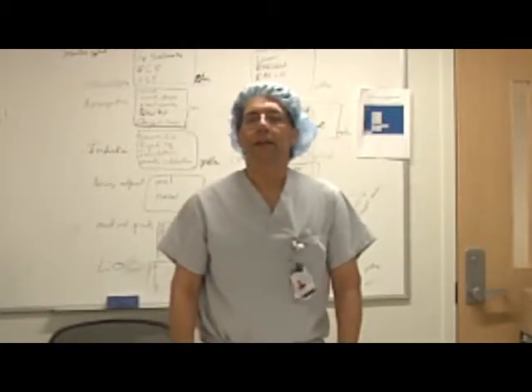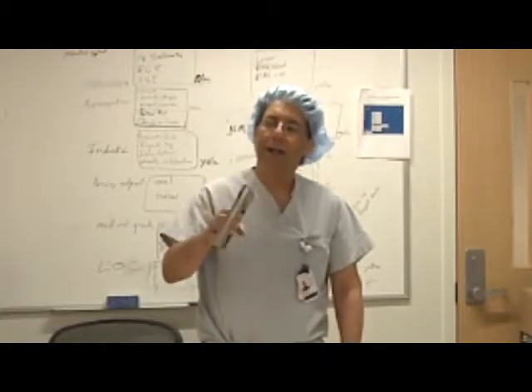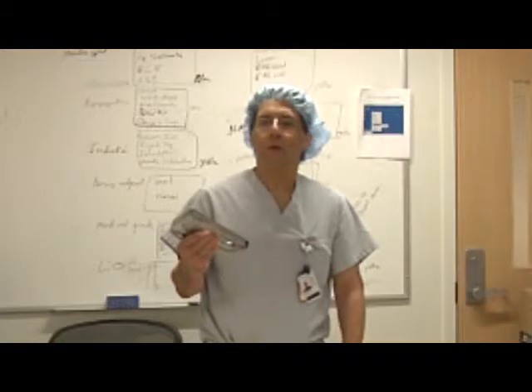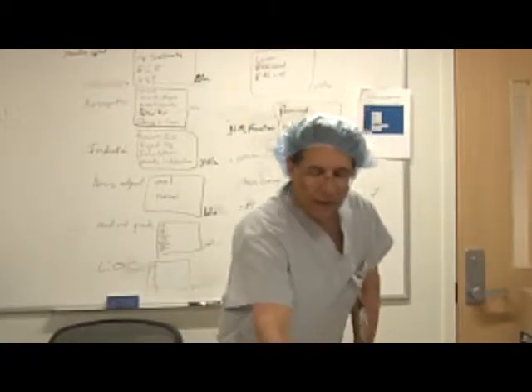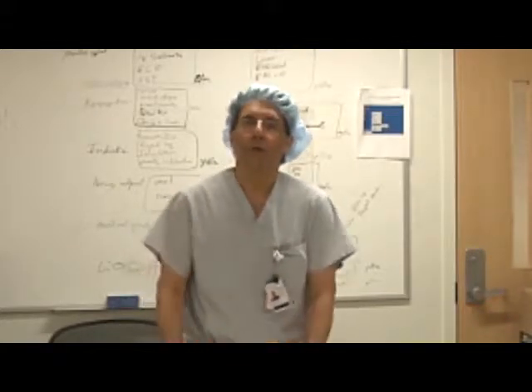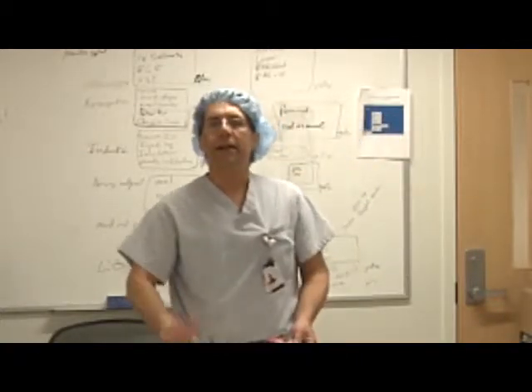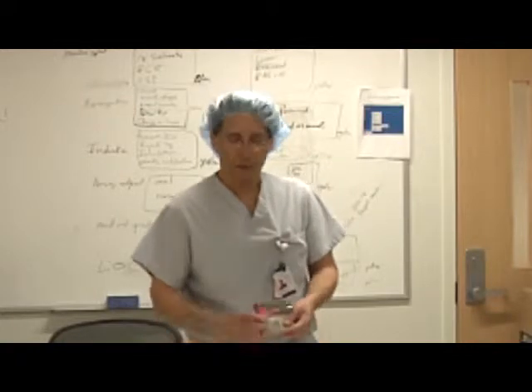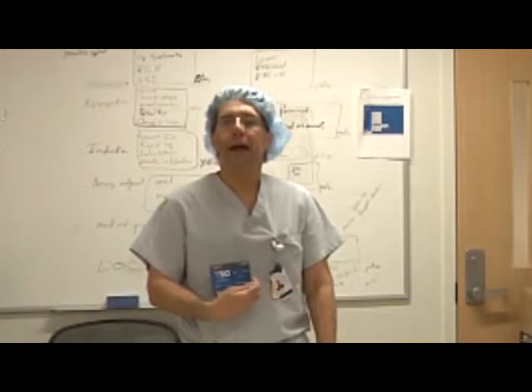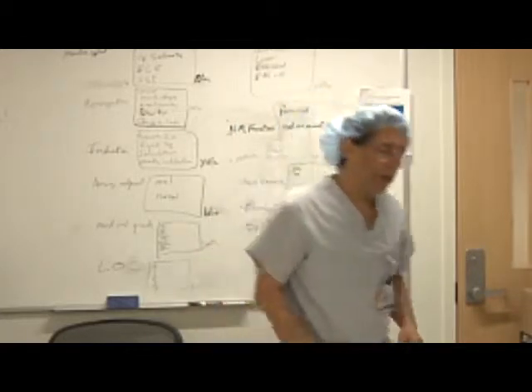Other supplies that we use include 1 or 2 heavy-duty stapler guns. These take a T50 staple with a size of 10 or 12 millimeters, and a pliers which will allow you to reuse the boards for a new trachea during the same workshop. I would advise that after the workshop the boards be discarded because they will be stained with swine secretions. I have a box of the 12 millimeter half-inch T50 staples here. You also might want to have a large bucket.